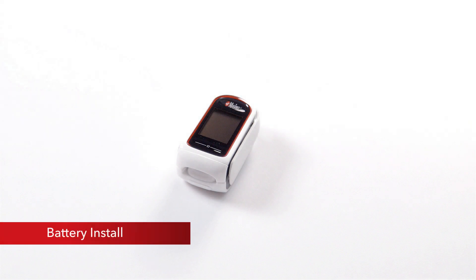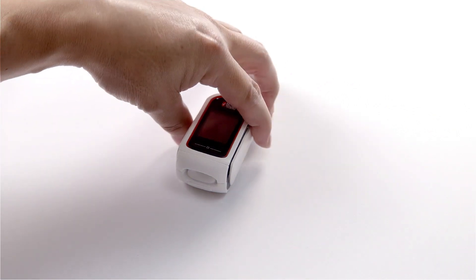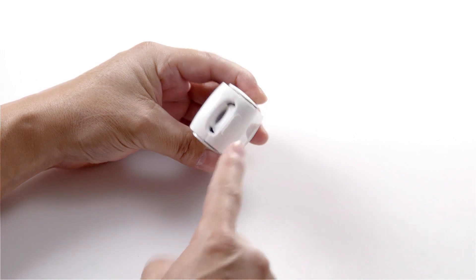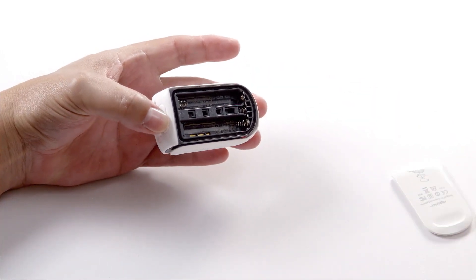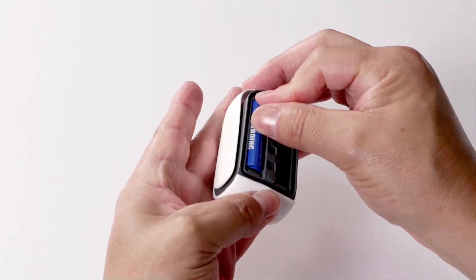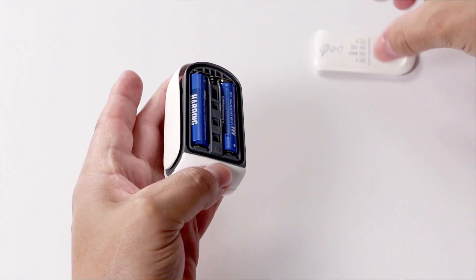Battery installation: The MidiSat RX requires two alkaline batteries to operate. Locate the battery button on the front of the sensor pad and push lightly on it to release the battery cover. Insert two new AAA alkaline batteries, carefully matching the orientation labels — positive and negative.